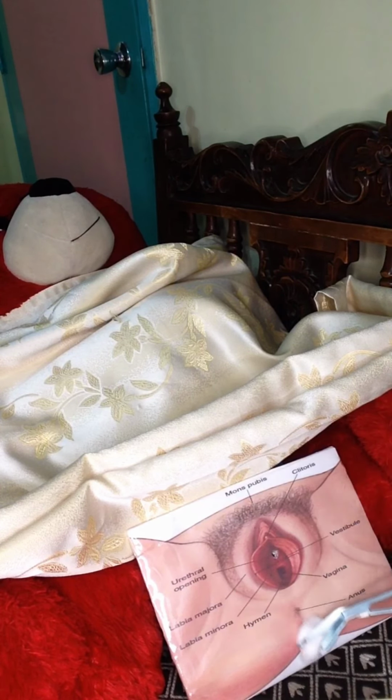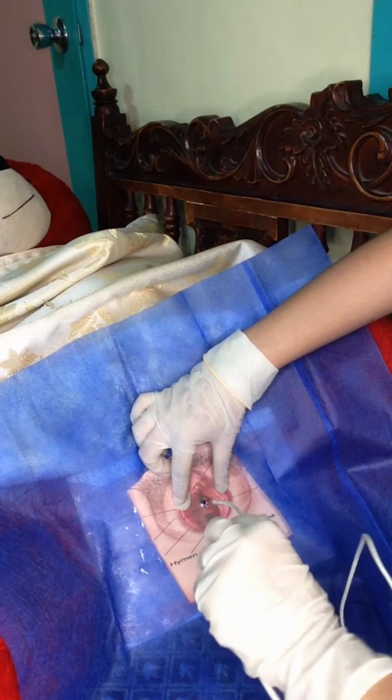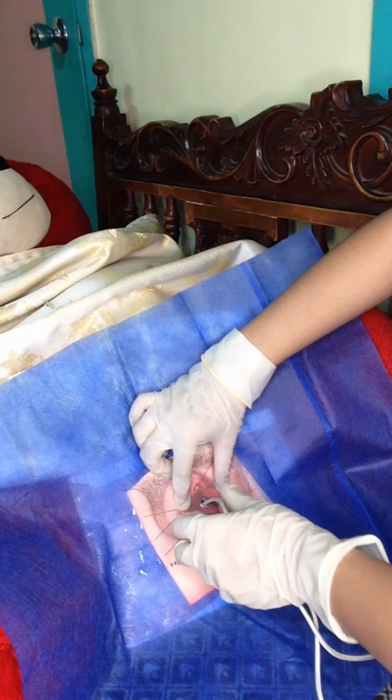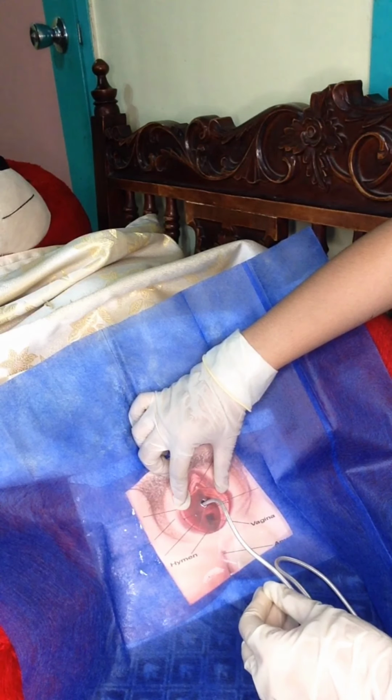So assuming that our balloon is inflating. Pick up the catheter at least 3 inches from the tip. Place the thumb and one finger of the left or right hand between the labia minora and separate and pull up gently. So, separate the labia minora and pull up and then insert the catheter. Insert the catheter into the meatus for 2 to 3 inches or until urine begins to flow.